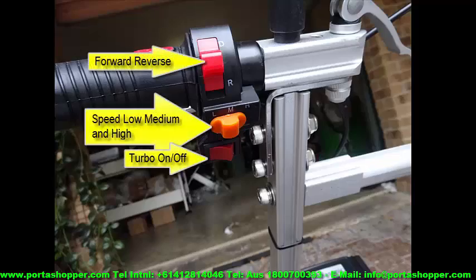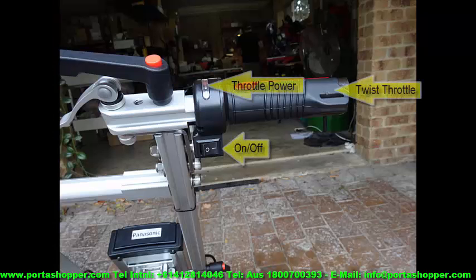So here I just want to show you the controls quickly. You will see on the left hand side you have the forward reverse switch, the low, high and medium speed switch, and then the turbo or overdrive switch at the bottom. On the right hand side we have the twist throttle like that of a motorbike, the throttle power indicator and the on-off switch at the bottom.